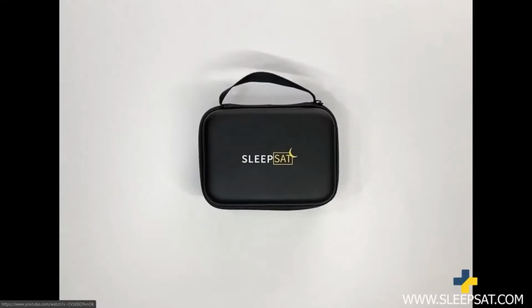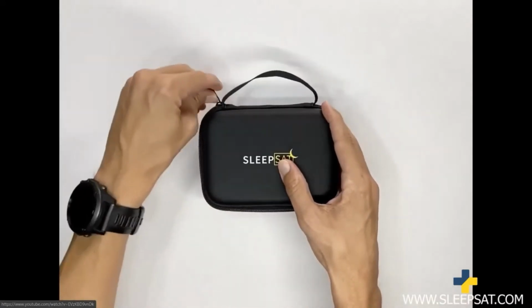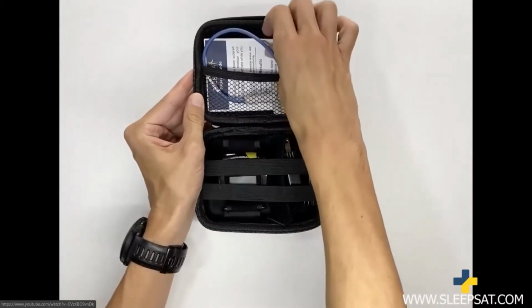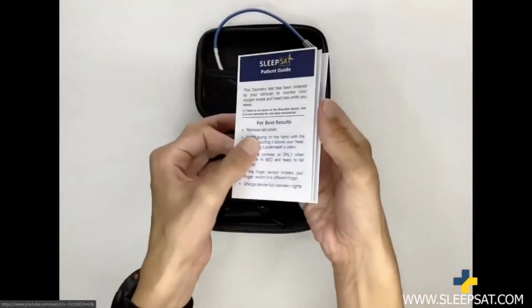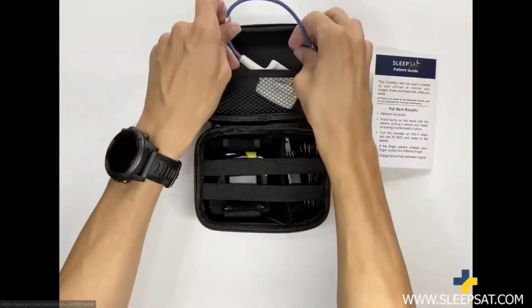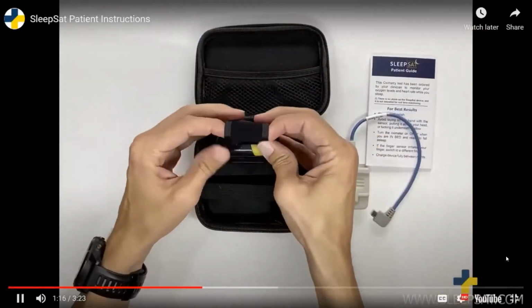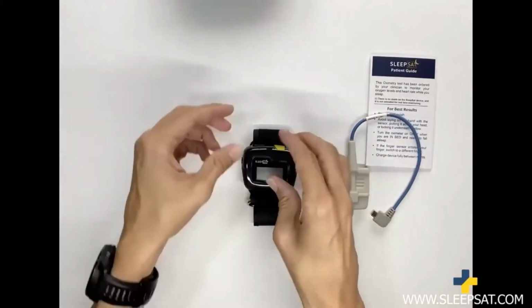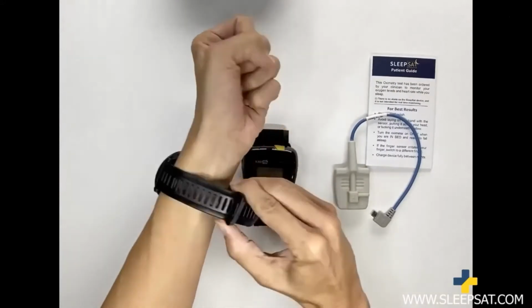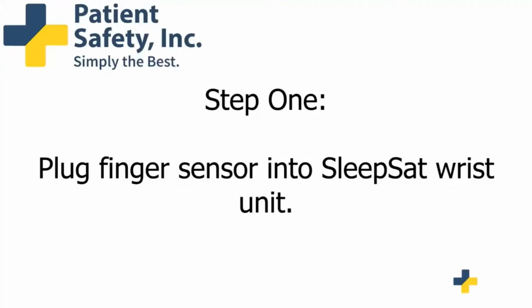To begin, take out the patient instructions, finger sensor, and the SleepSat device. Remove your watch and any jewelry you are wearing as well. When you're ready to fall asleep, step 1. Plug finger sensor into SleepSat wrist unit.